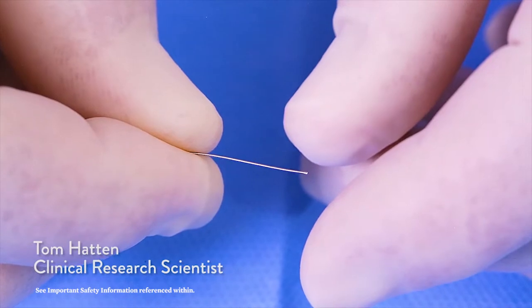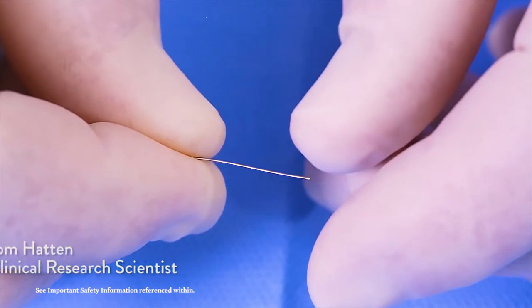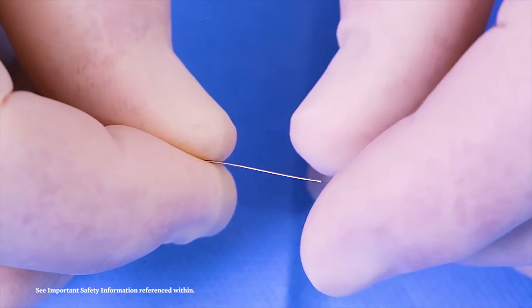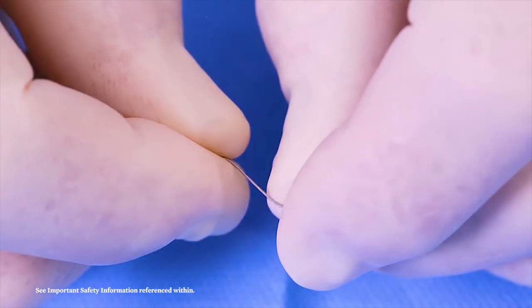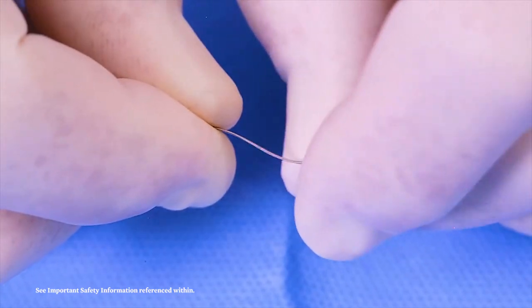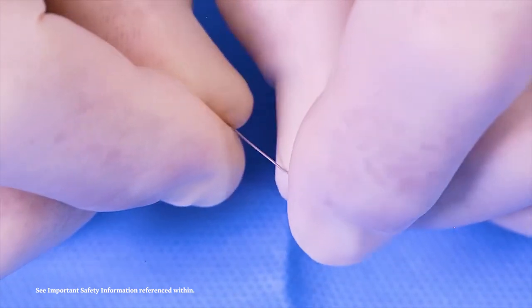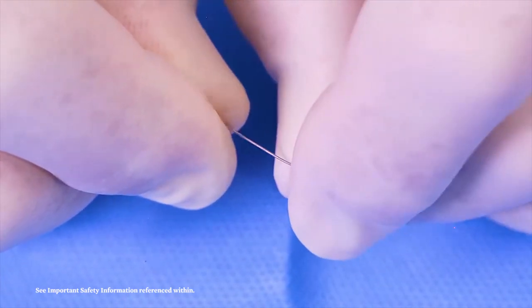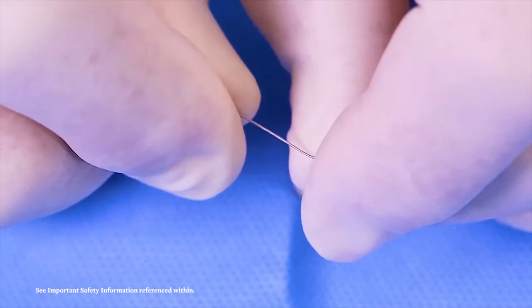You can also shape the guidewire without using an accessory device. Expose the end of the guidewire, then use your fingers to pinch and apply gentle pressure as you pull, and you can impart a shape to the tip of the guidewire. The more force you use, the more shape will be imparted to the guidewire.